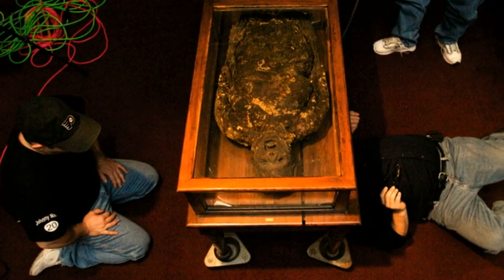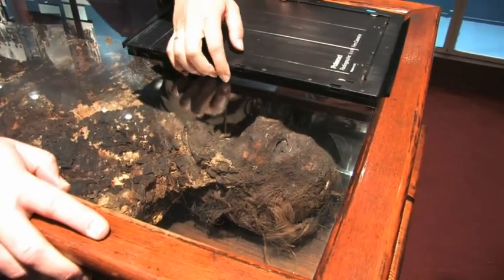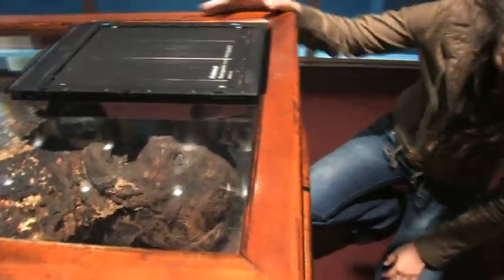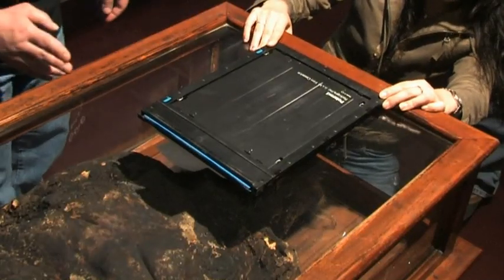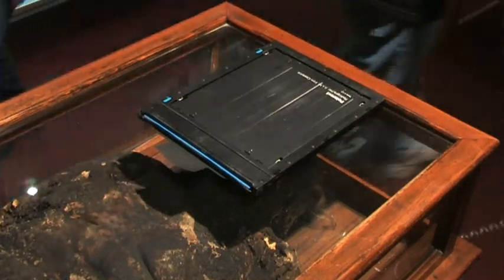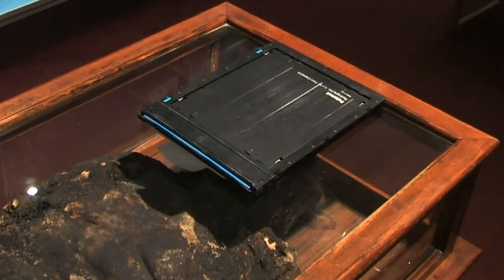What we're doing tonight is bringing technology that has been developed over the past 20 years to produce the best images available today. We're going to be using Polaroid photographic film and industrial x-ray plates that were intended for industry, because we're going to get better detail. Medical imaging plates were developed for hydrated, living individuals. There's no water in the soap lady's body at all, so we have to find another technology. The one that works best is industrial imaging technology.